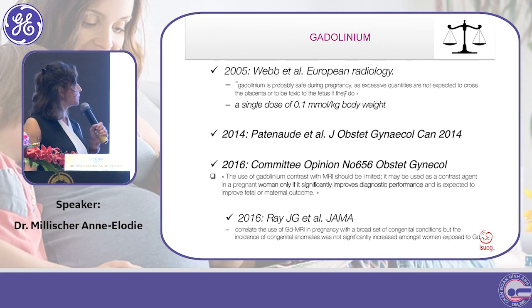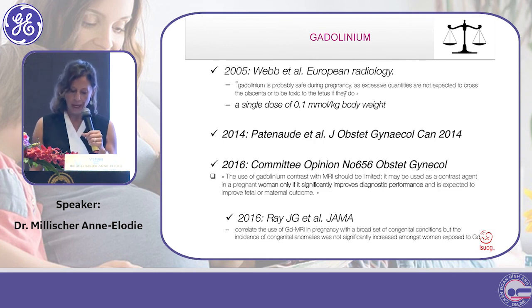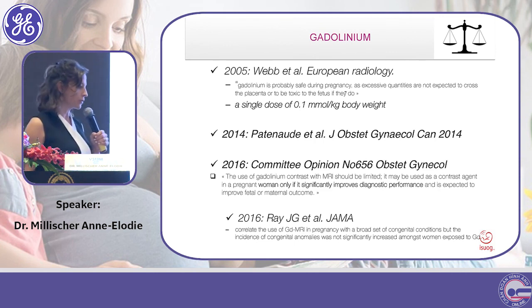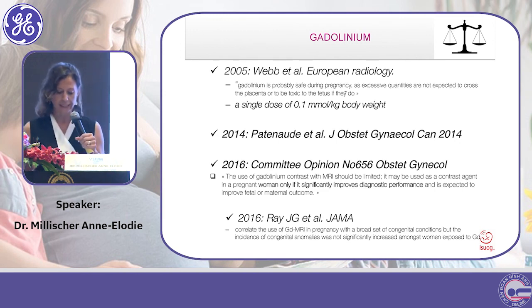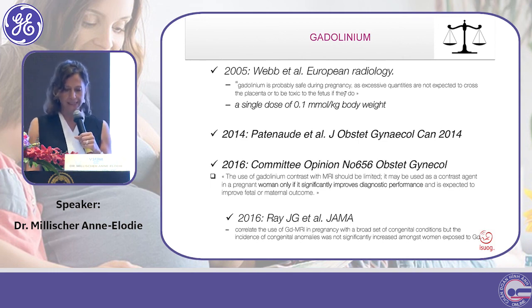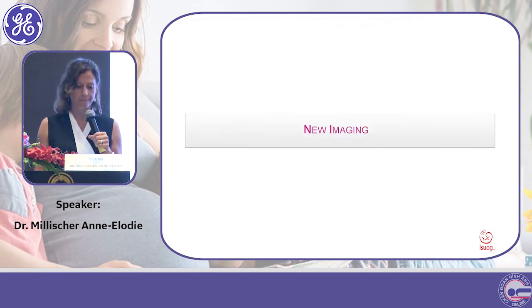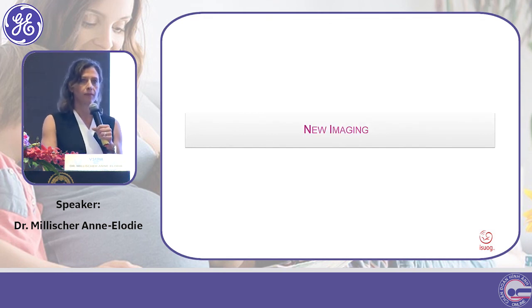But the use of contrast during pregnancy is questionable, so we have to do a balance between the risk to do contrast in a pregnancy and the risk for the mother to have a placenta accreta. Nhưng mà cái việc mà tiêm thuốc cản quang vào nó vẫn còn là vấn đề rất là tranh cãi, cho nên nhiều khi mình phải cân nhắc giữa cái lợi và hại của mẹ và của bé để có quyết định tiêm thuốc hay không.